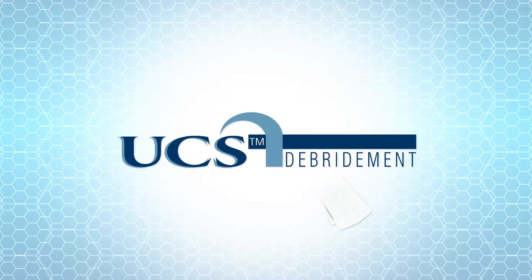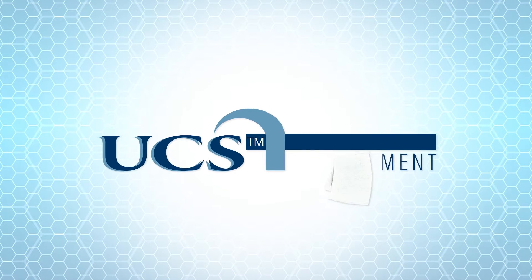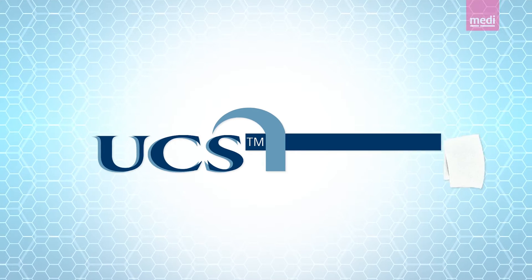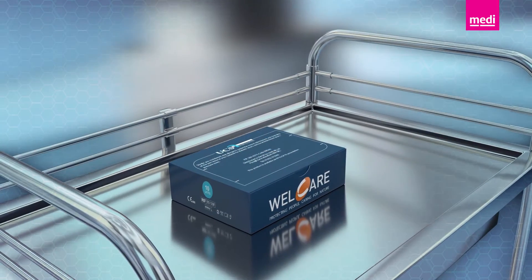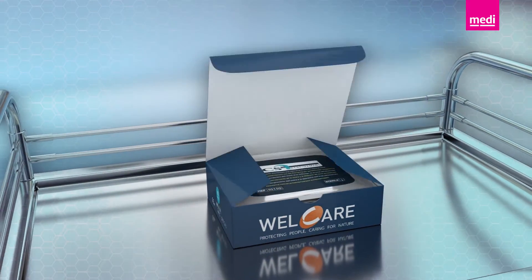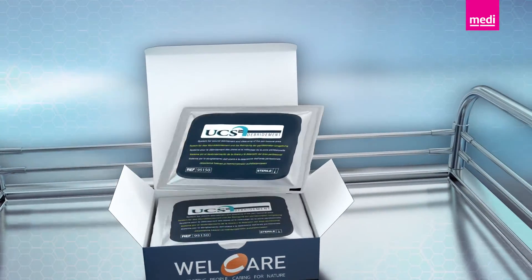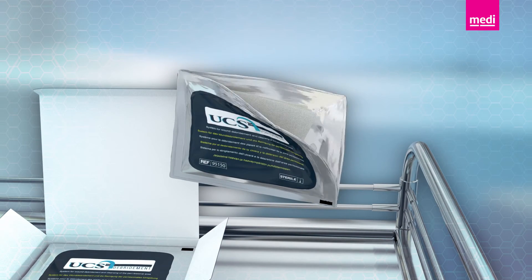There are many barriers that affect healing of wounds. Gently wipe them away with the all-in-one UCS debridement cloth from Medi. Wound debridement at an early and appropriate stage is likely to accelerate wound healing and improve patient care. The UCS debridement cloth is unlike any other debridement product on the market.